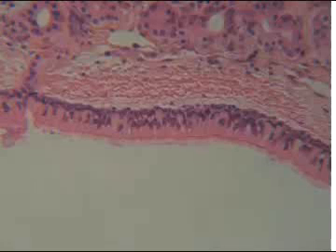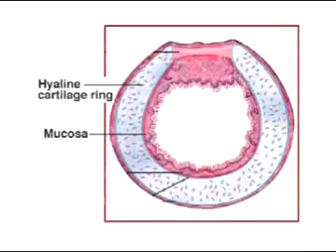Okay, we'll start with just a quick review of the respiratory epithelium. This is actually a real picture from the Mount Hood Histology Library, so you can see that it's pseudostratified, with pretty lengthy cilia at the apical surface. Just remember, it looks stratified, but the nuclei are at multiple levels, so that actually designates it as pseudostratified.